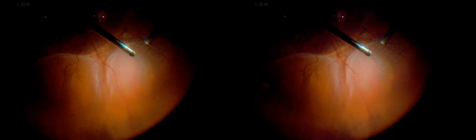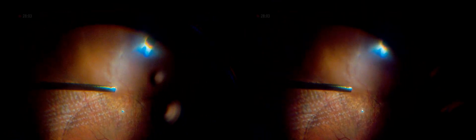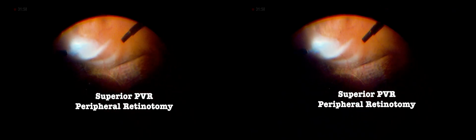To address superior PVR (proliferative vitreoretinopathy), a retinotomy was performed to locally relieve retinal traction. This aimed to counteract gravitational force towards the superior temporal arcade, preventing further advancement. The cut was oriented toward the retina, taking care to avoid peripheral vessels, ensuring a clear media.